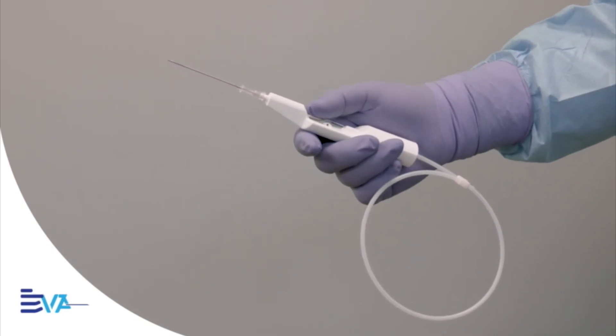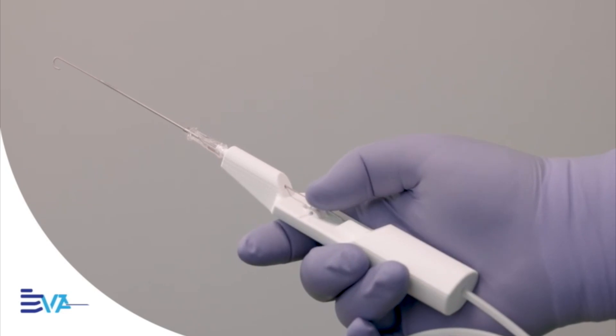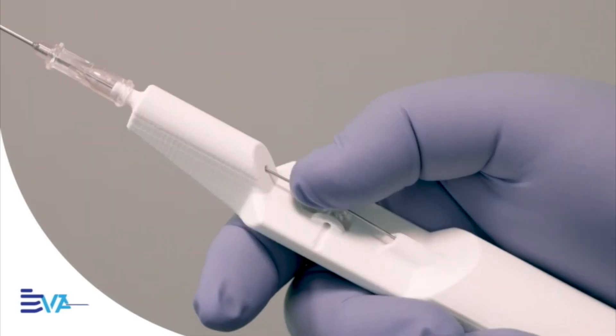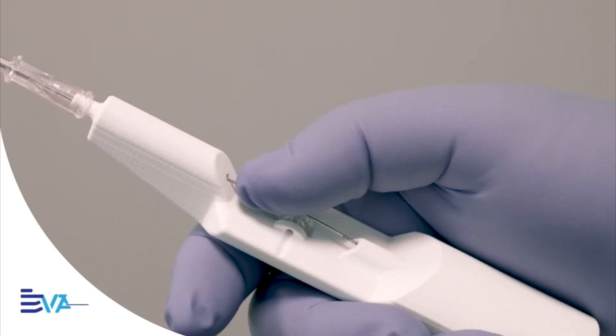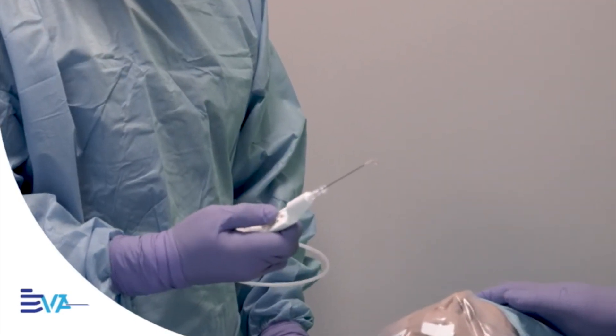We developed a one-handed Seldinger Technique — streamlined, intuitive and immediately usable. Whether you're just starting or have placed a thousand lines, it fits your workflow and your hand.